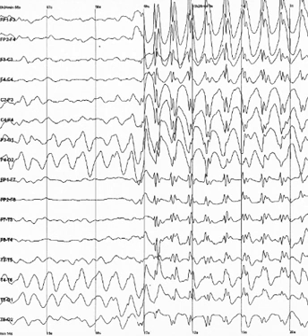Electrode locations and names are specified by the International 10-20 system for most clinical and research applications, except when high-density arrays are used. This system ensures that the naming of electrodes is consistent across laboratories. In most clinical applications, 19 recording electrodes plus ground and system reference are used. A smaller number of electrodes are typically used when recording EEG from neonates. Additional electrodes can be added to the standard setup when a clinical or research application demands increased spatial resolution for a particular area of the brain.